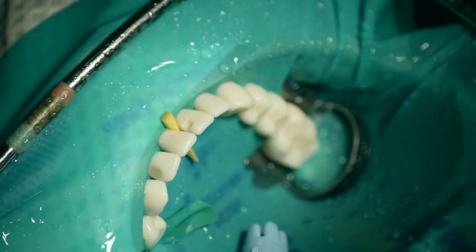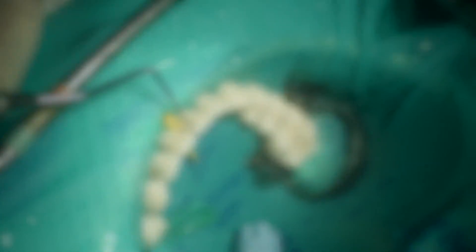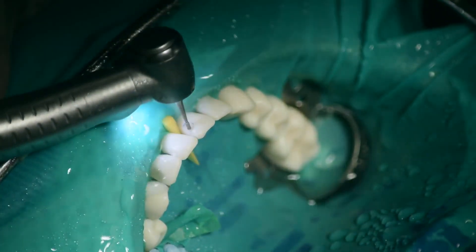While preparing the cavity, you need to check the depth using a periodontal probe to make sure that it's not too shallow or too deep.